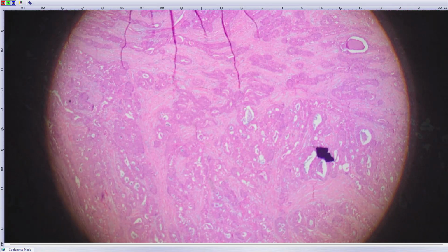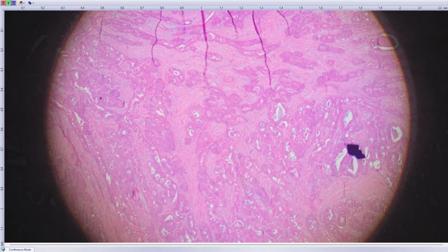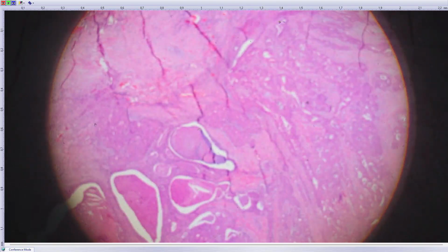Okay, Alena Skalova speaking. I have a very simple case just to make it more variable. This is, of course, a tumor of parotid gland. I received this case as a consult case, and it was a large tumor, 6 by 4 by 3.5 centimeters in diameter, and the tumor was in a 74-year-old lady.